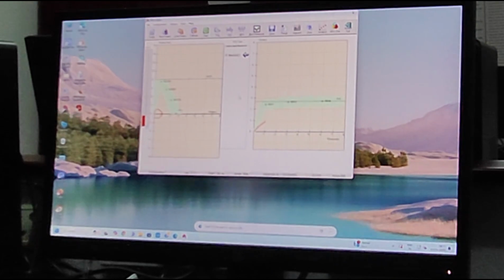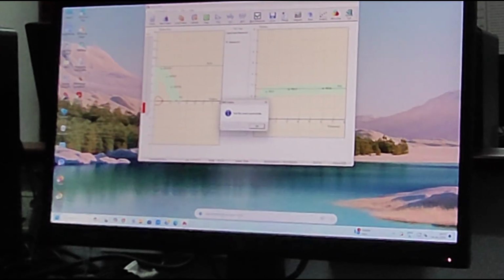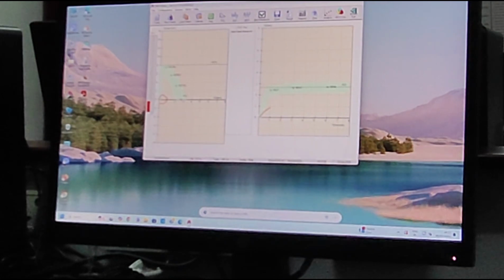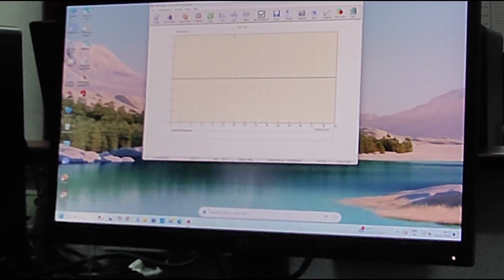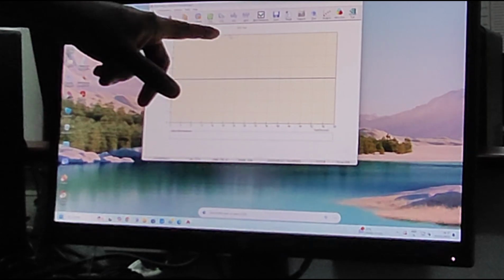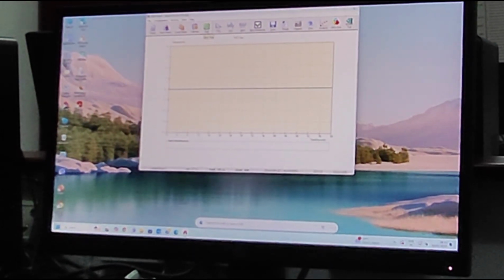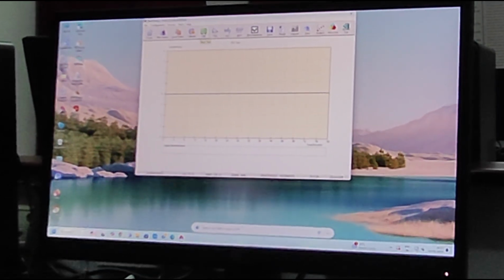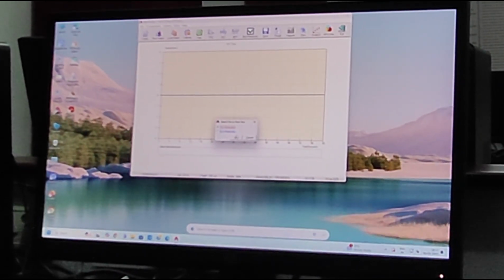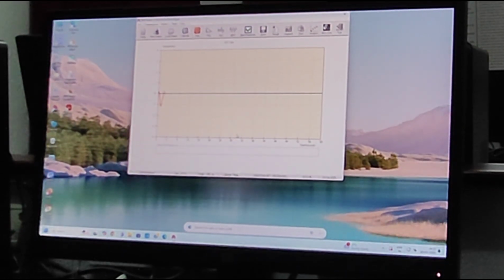Once the test is completed, we can click the save button. For the second test, we have the option to choose it. Once it is chosen, click start test, the link will be created, and by pressing start the test will begin.